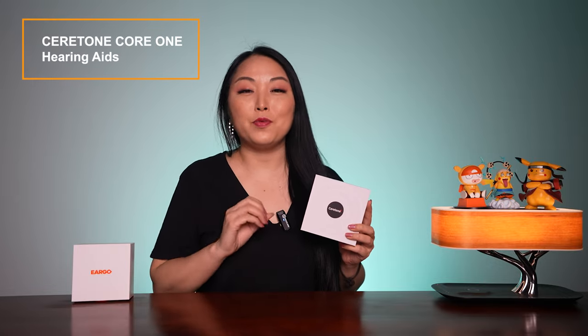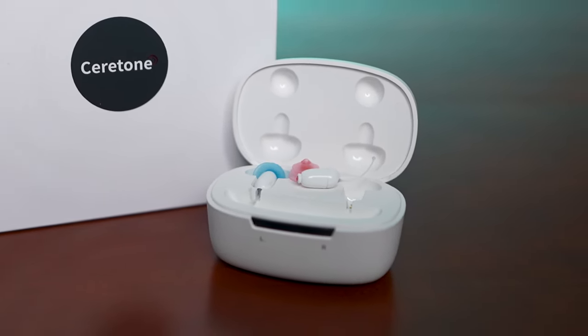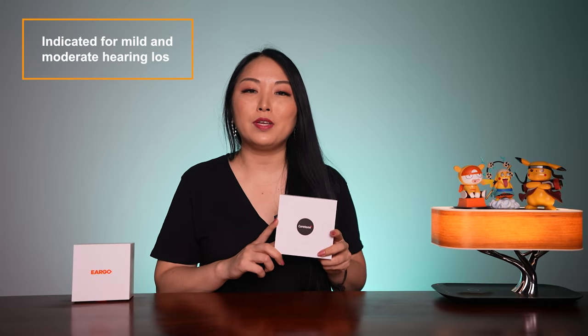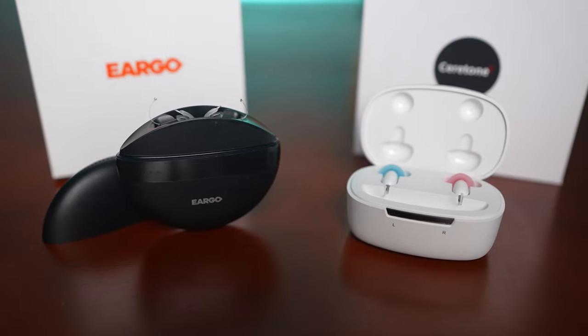Hi, I'm Simi and today we will check Seroton Core 1 hearing aids. This is the smallest OTC hearing aid in the market. It's designed for those with mild and moderate hearing loss, and today I will make a quick comparison with Eargo 6 because they are in the same category but Core 1 is much cheaper.